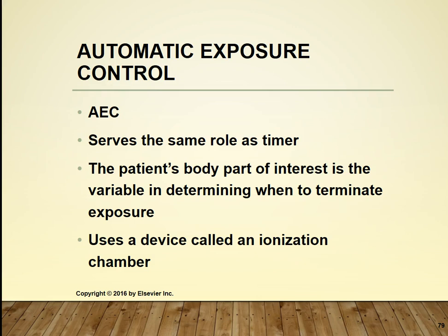And the amount of exposure varies with the image receptor, and it'll have to be recalibrated if anything changes. So when we went from film screen to a type of digital, which was CR first, a cassette-based digital, they had to recalibrate. But you can still use the same equipment. Then when we went to full digital or DR, that's direct radiology, they had to do it again because it's going through less materials to get there.